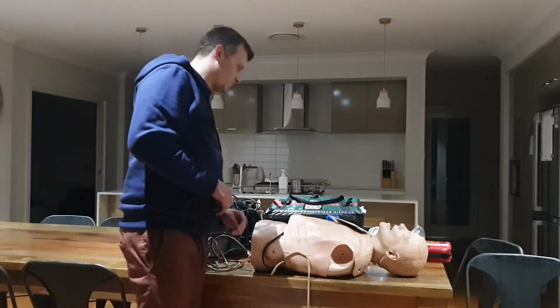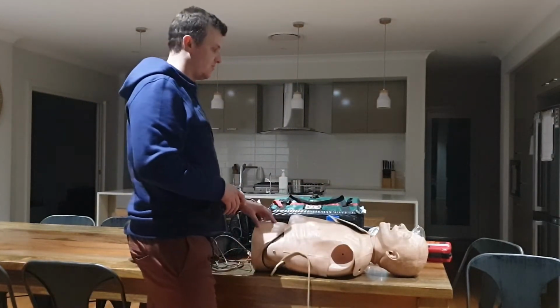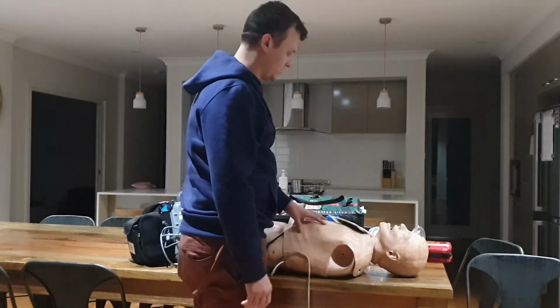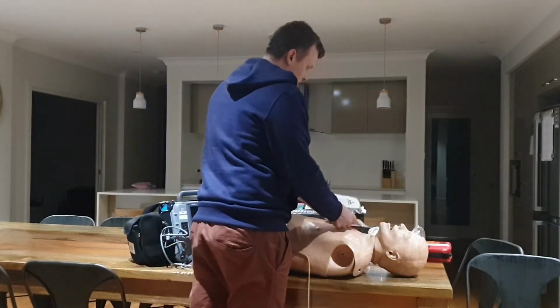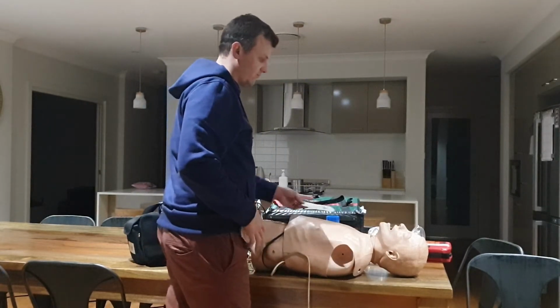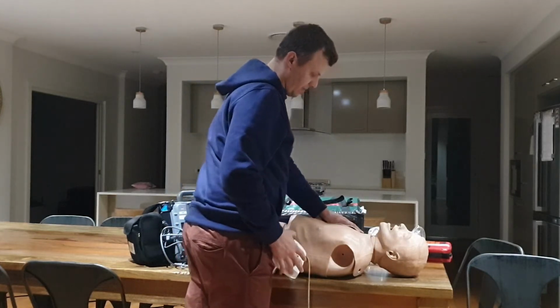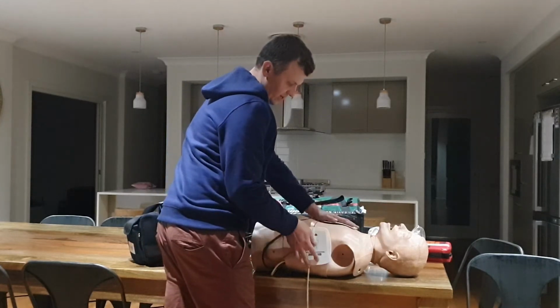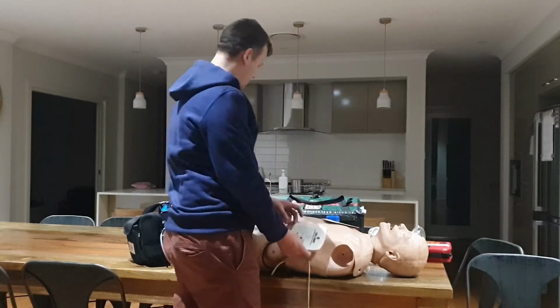Next thing to do is, you've got everything set up, got your patient monitored, you've checked their blood pressure, you've got their respiratory rate, so you've got a good baseline set of observations. Now you're just going to apply the pads. With the pads, you want to place one pad under the right clavicle and then one below, just on the left side there as well. So it follows the conduction motion of the heart.